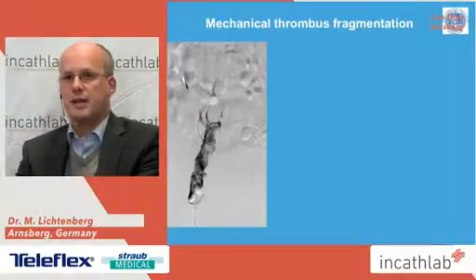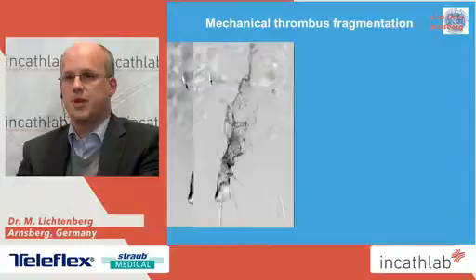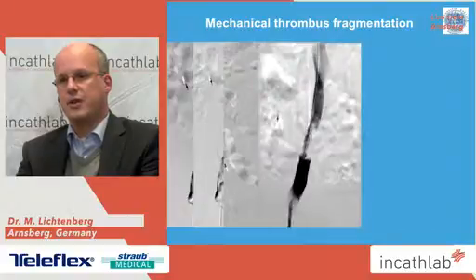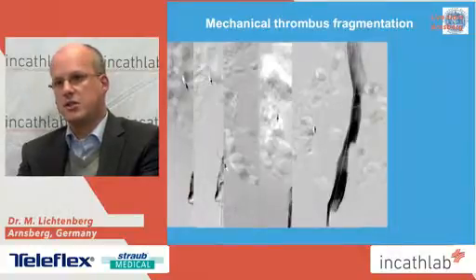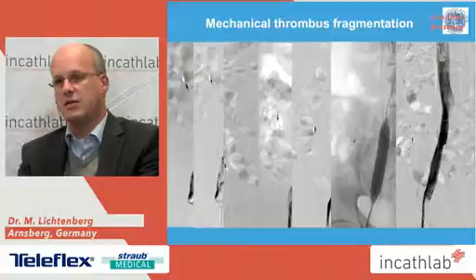Here's a typical example of the Rostock group. Patients with a descending DVT, and they performed a thrombectomy with a 10F system, and after this they stented the underlying reason, a compression syndrome, and you can see afterwards a very good inflow after efficient treatment.